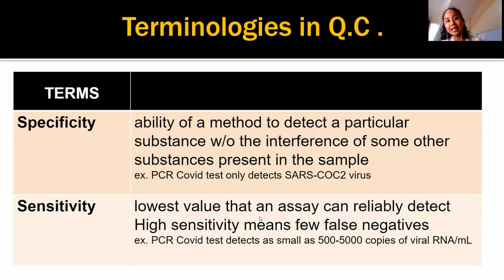But if you use a drug confirmatory test, like gas chromatography mass spectrophotometry, GCMS, the confirmatory test for drug testing, it is so highly sensitive that even if you have only a small amount of THC in your urine, you will test positive. Even if you only used it once in a while and only took a little hit, class, you can test positive because the test is very sensitive.